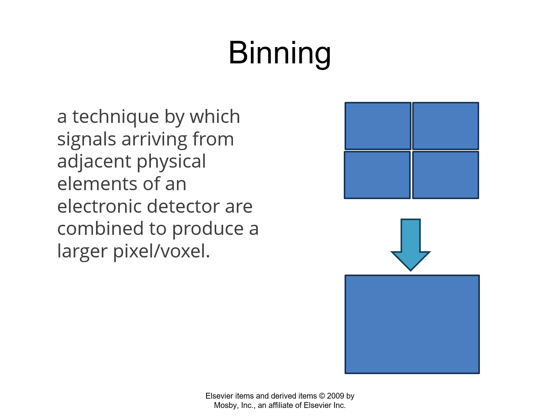Okay, and so binning is special to digital technology. You can do it with a still image, but you're going to notice the loss in spatial resolution. It's really when we're in a motion picture loop and multiple frames per second, and the pictures are flying by your eyeballs so fast, and we're refreshing that screen with a new image very rapidly, that you're not going to notice the loss of spatial resolution. And it's a way to make the software process images faster.